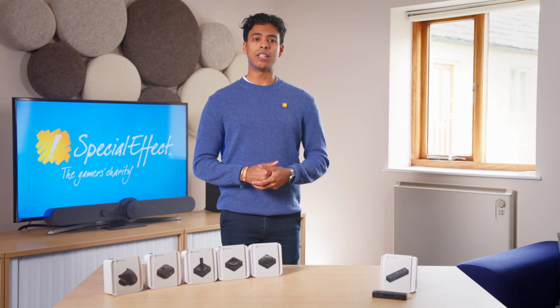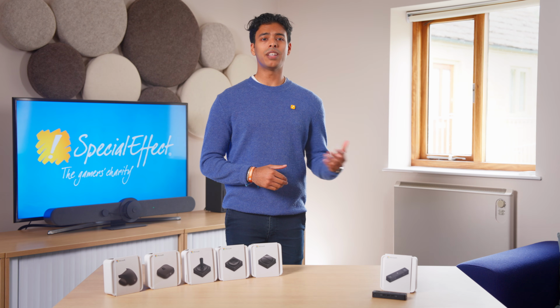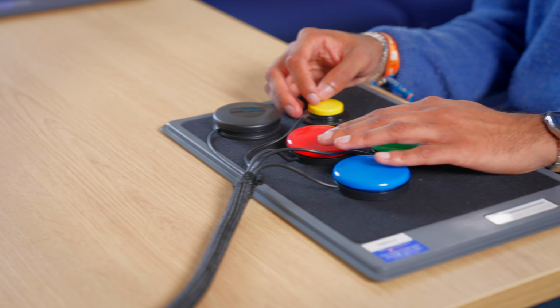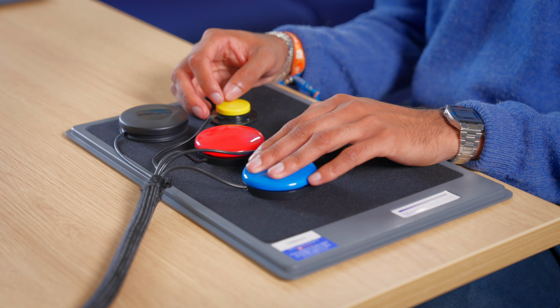Many of the available PC switch interfaces are not designed for playing games, but instead made to be used for singular switch outputs used for switch scanning. Therefore, they may not allow for simultaneous use of the switch inputs or register a switch being held down.